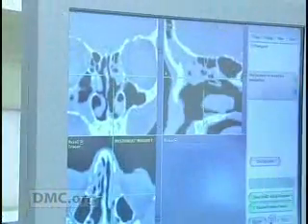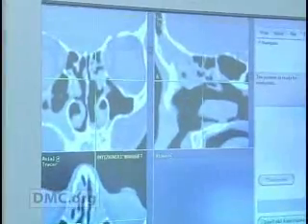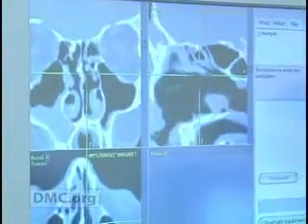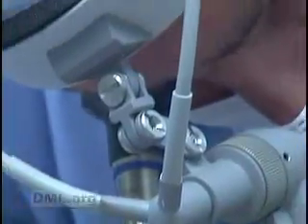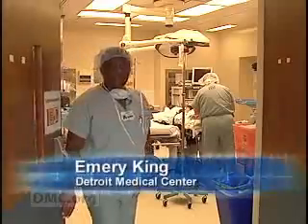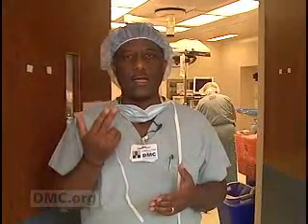The beauty of image-guided surgery is that we don't enter into the bone that surrounds the eye. We don't enter into the bone that separates us from the brain. It's a way to allow us, hopefully, to do the procedure more safely and more completely. The patient is being awakened now. She'll be released later today, maybe with a little discomfort because of the nose packing, but she should be 80–85% recovered within 2 or 3 days, completely recovered within about 6 weeks.